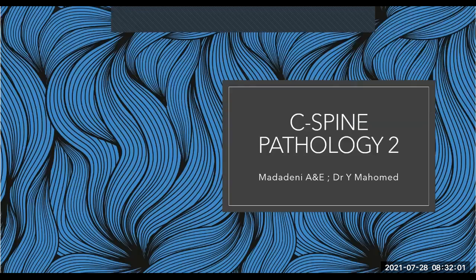If you have a chance, just have a look. The two previous lectures were about how you look at C-spines, and then we covered some examples. But because you guys hadn't seen it before, I'll try and go through it a little bit in this one as well. Today was actually just meant to be a little look at some other types of C-spine pathology and things that you can see on the C-spine.